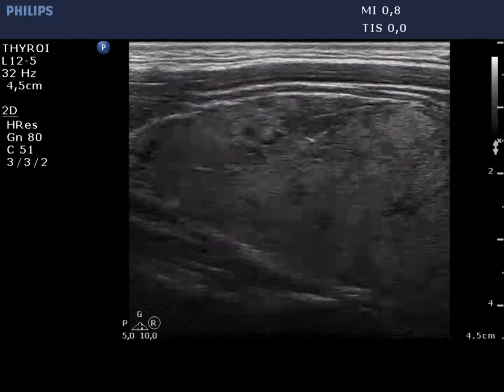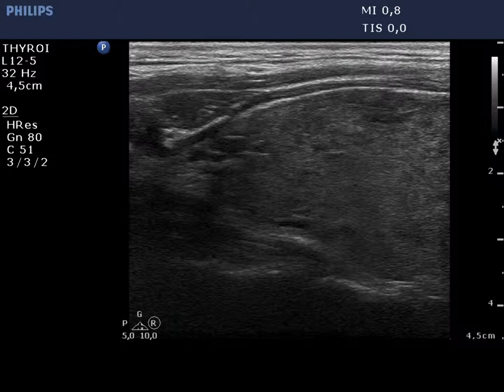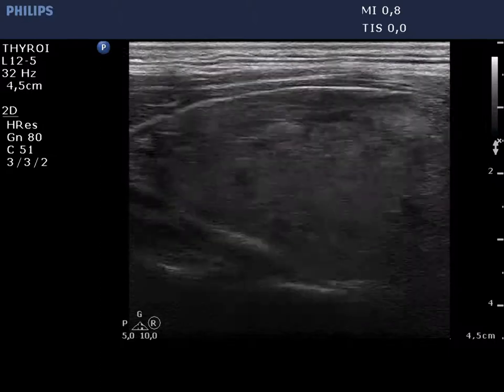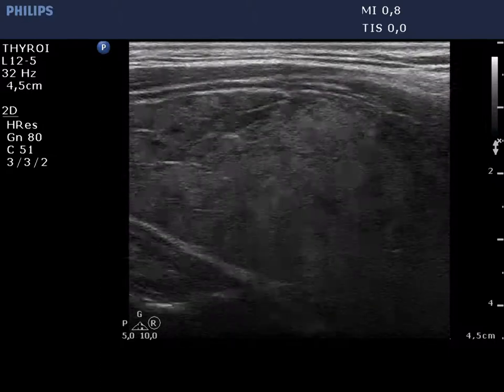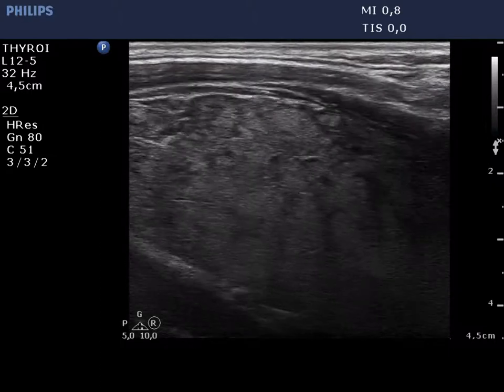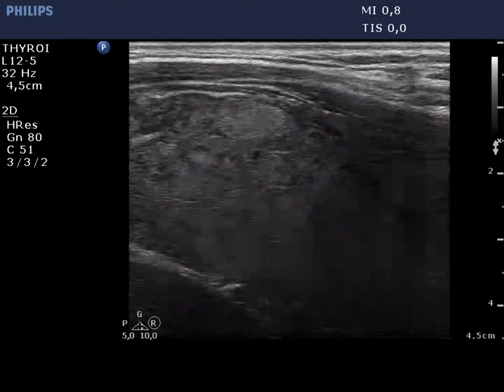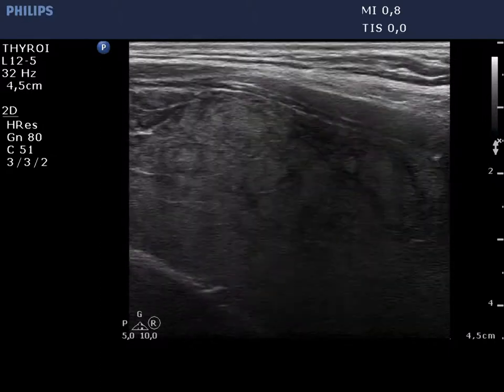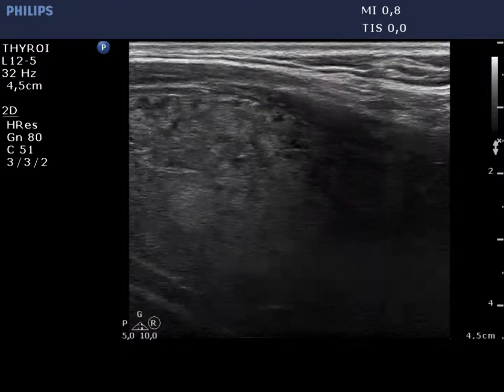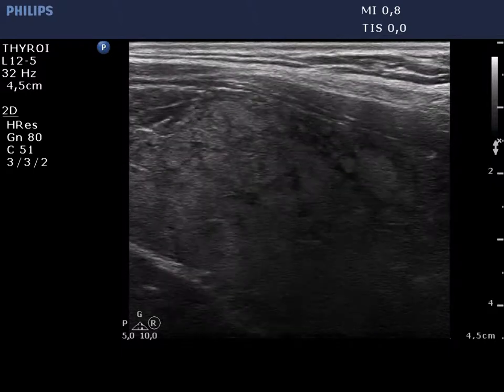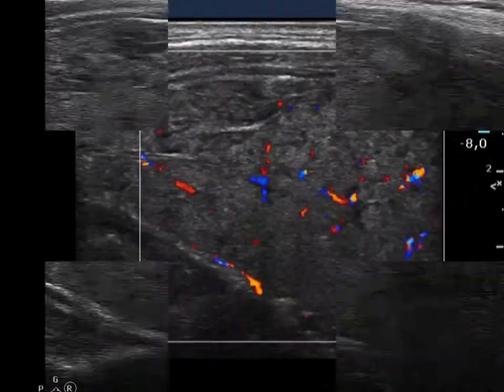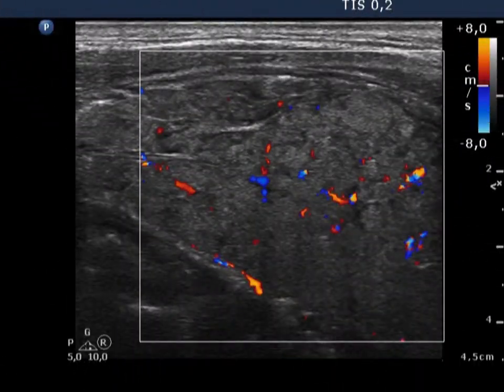The size of the thyroid presenting the pseudonodular form is significantly greater compared with the usual forms of Hashimoto's thyroiditis. The extralesional part is hypoechoic.